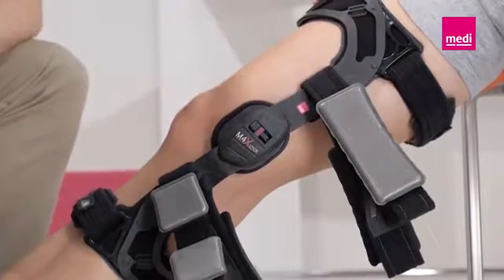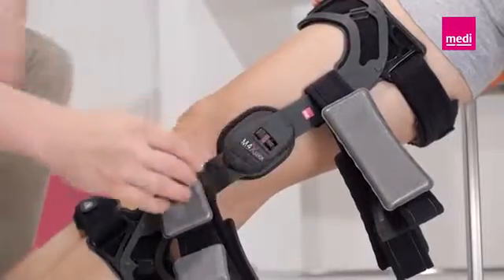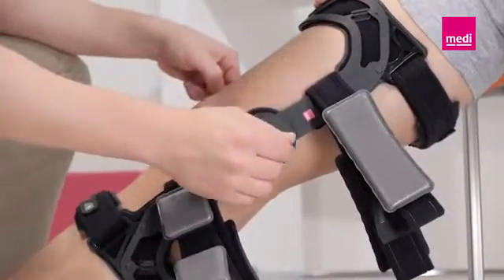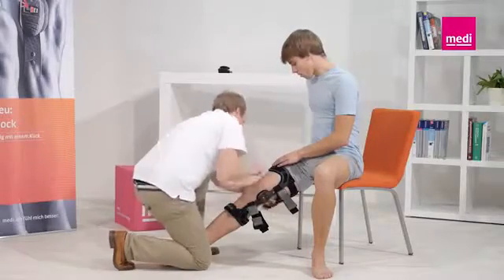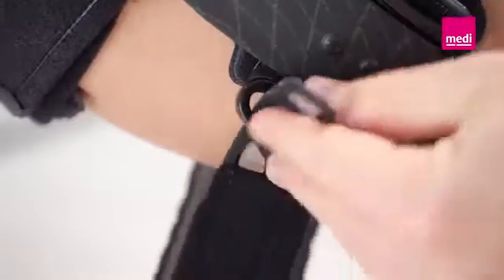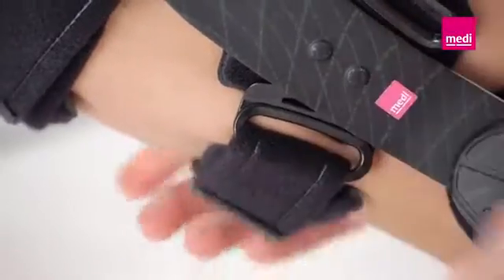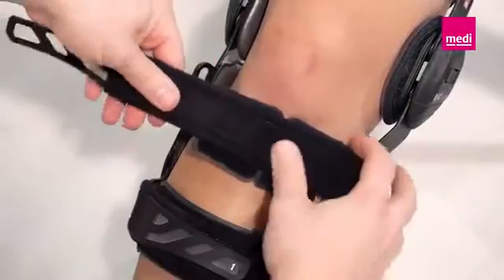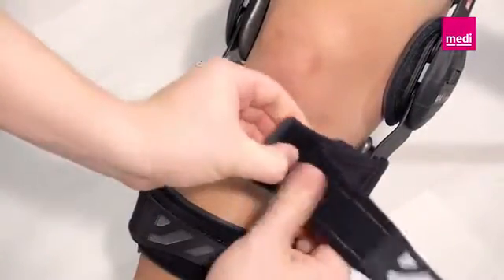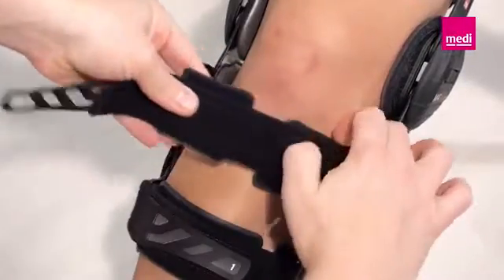Now, push both orthosis hinges backwards towards the back of the leg. Make sure that the hinges are positioned behind the lateral medial midline of the leg. Now fasten straps 3, 4, 5 and 6. Please note that the pads on strap number 4 are split. These can be positioned around the scar if need be, to avoid unnecessary pressure on a possible surgical scar.